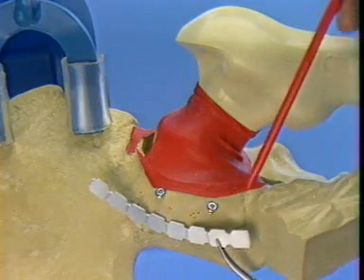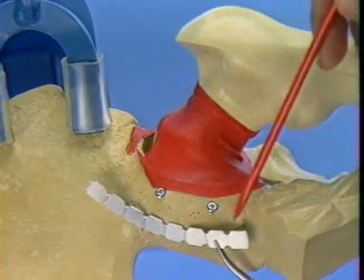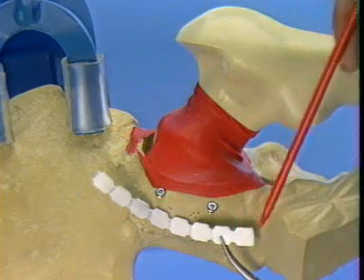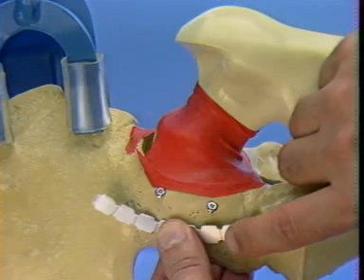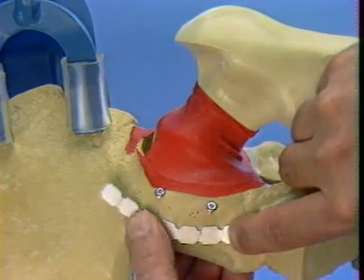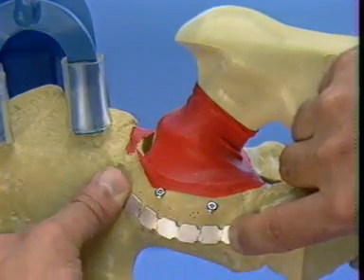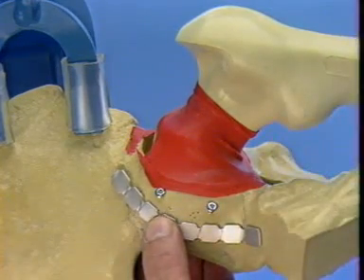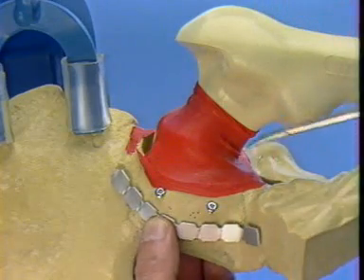In this case, one screw hole will be completely above, as well as below, the posterior wall fracture segments. The distal end of the plate will be sharply upturned on the superior pole of the ischial tuberosity.